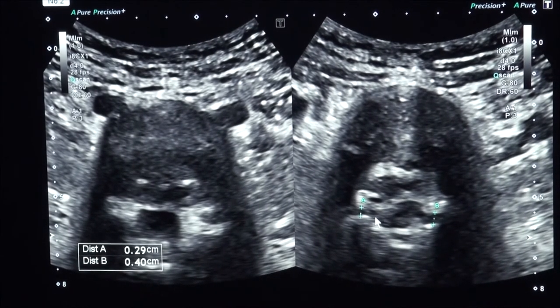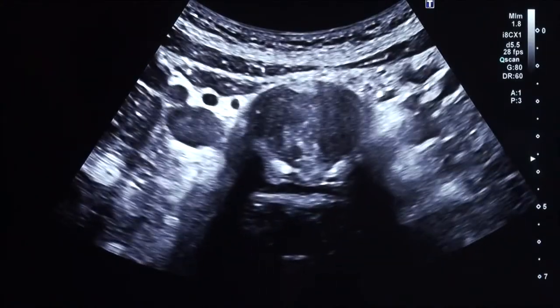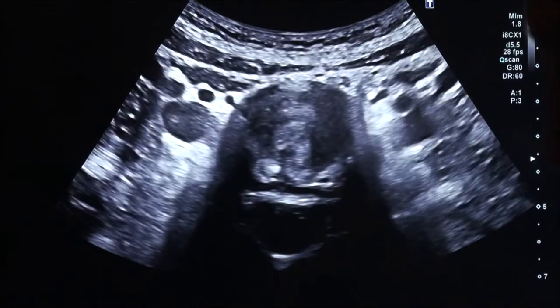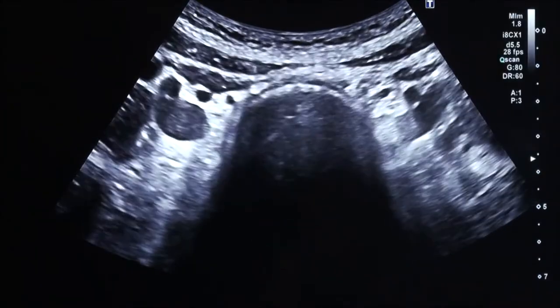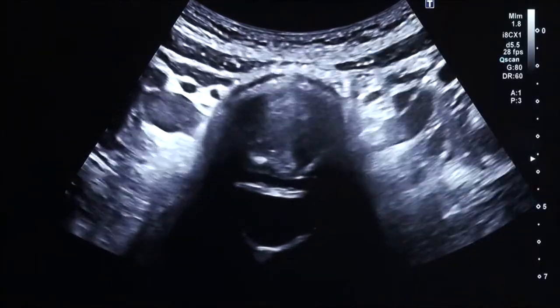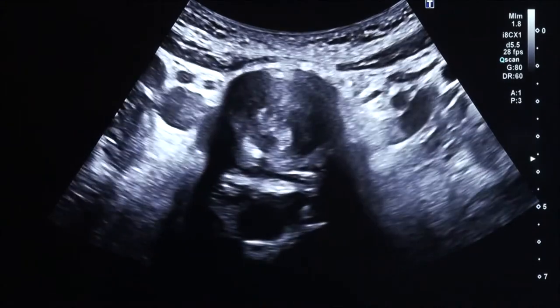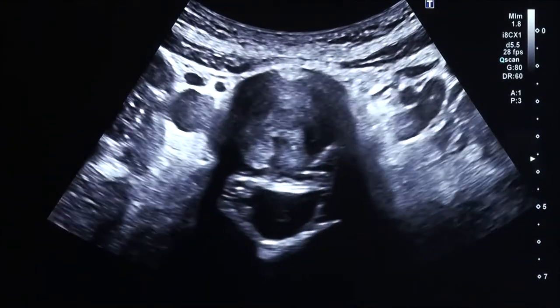Now we're going to demonstrate how we do it. This is a transabdominal view of our subject — this is not the patient whose images we showed before. This is someone from the office with a very skinny belly, which is easy to penetrate with the ultrasound. So this technique does have limitations.